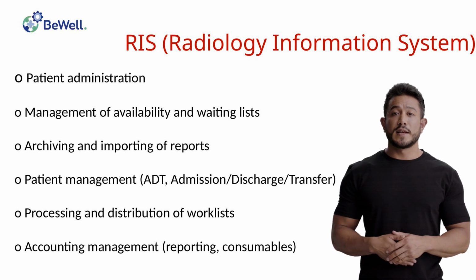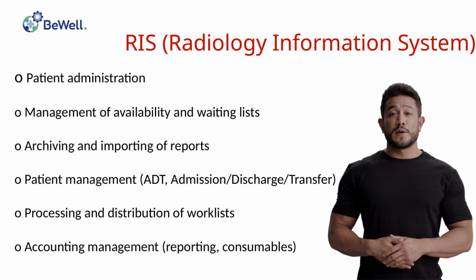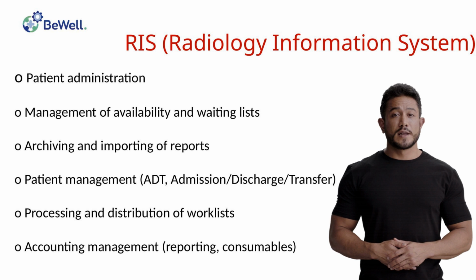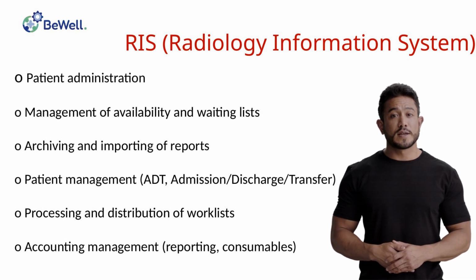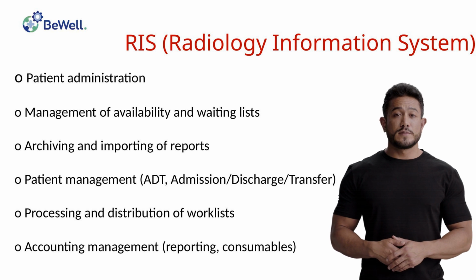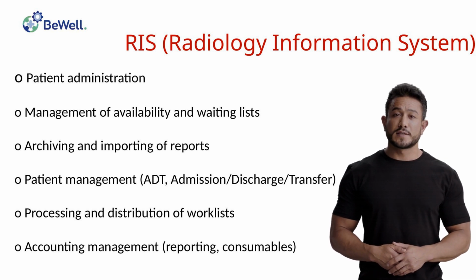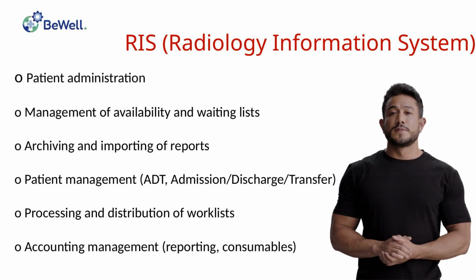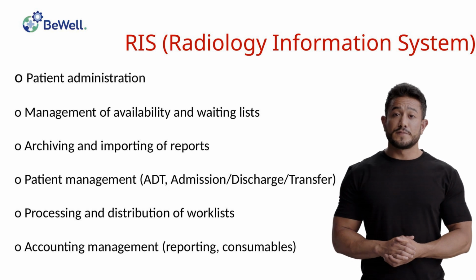Following the previous lesson regarding the technical and design specifications of a RIS PACS system, it is necessary to delve into the specific functionalities and applications of RIS. RIS offers numerous advantages in the management of a radiology department, including patient administration, management of availability and waiting lists, centralized appointment booking center, archiving and importing of reports, medium and long term.